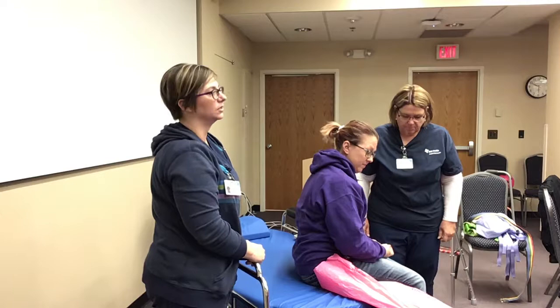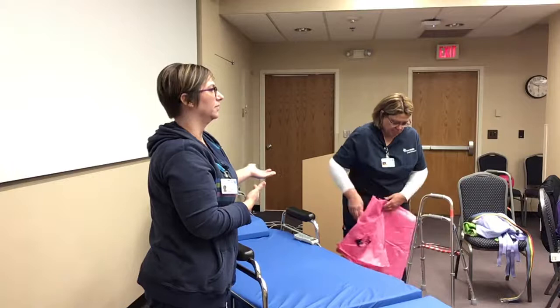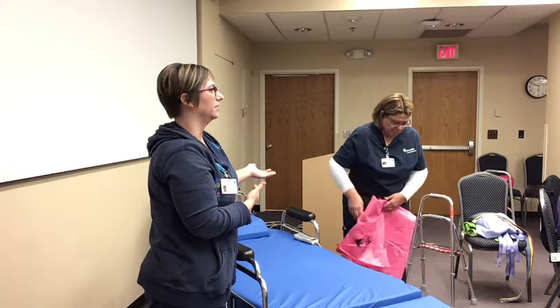Use your lifts as well — that's what they're there for. To boost your patients, to roll your patients — especially those max assist patients that are constantly sliding down to the end of the bed. Put the full lift sheet underneath them and lift them up. I answered a call yesterday and she was clear down to the bottom of the bed. I started hooking up the lift for her, and she said, 'Oh, thank goodness — I'm glad you're lifting me with this lift. It hurts so bad when they just take the sheet and boost me up.' So listen to your patients — they really do prefer to have that lift.